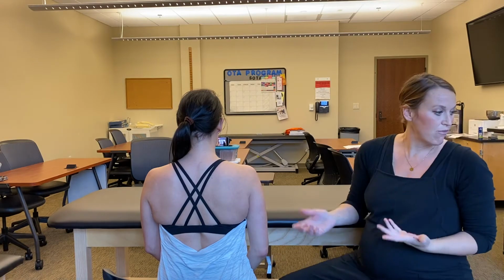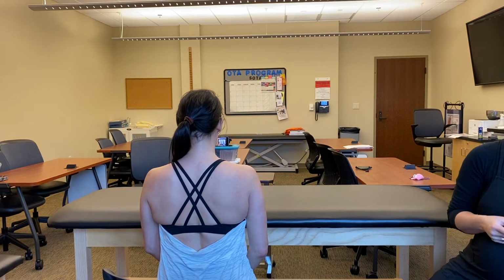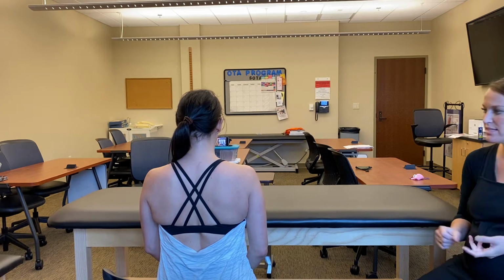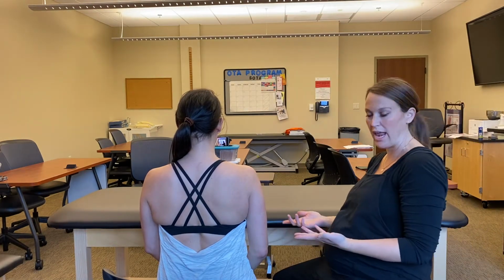First, we're gonna look at flexion. So the muscles that contribute to shoulder flexion are the anterior deltoid, the coracobrachialis, and the pectoralis major. Normal range of motion is 0 to 180.